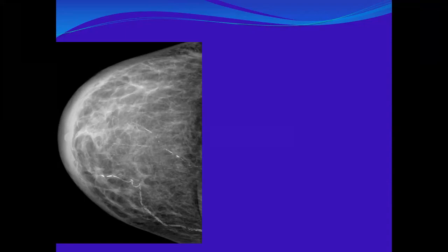Okay, another. I gave you a clue, but you didn't use it. Yes, you said late 40s. So what about the patient's age? Is she old? She's not old. Not reached 50. So still she is premenopausal. She is not diabetic. She's young, not diabetic. Okay. Can we just follow mastitis?